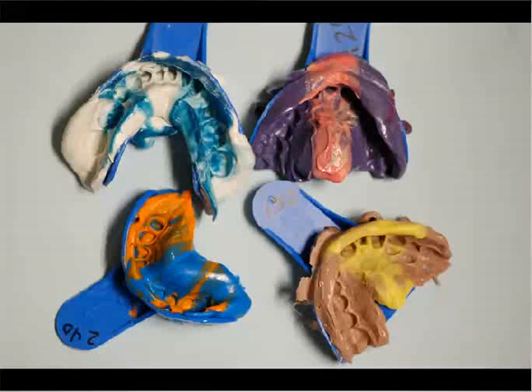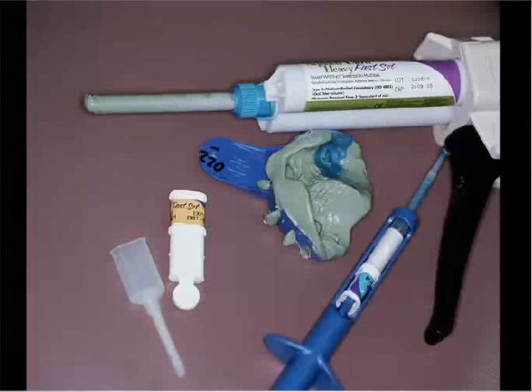You can see just from this quick photo, there's a lot of different colors out there. Some are kind of stimulating, but some are hard to identify when it comes to the margins, and you get too much reflection. I prefer the grays, the blues, the browns that allow you a little lower value and something which you can really easily identify the proper margin.